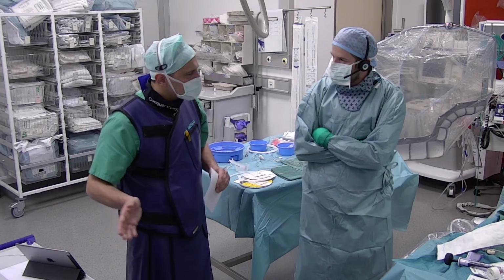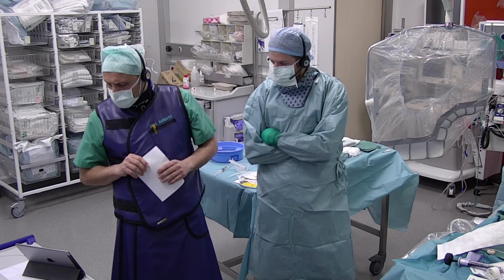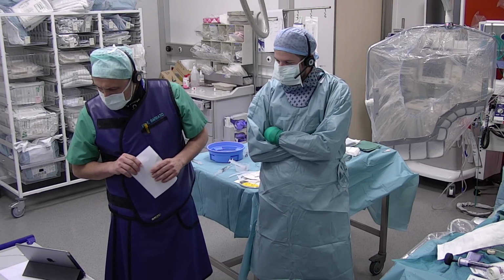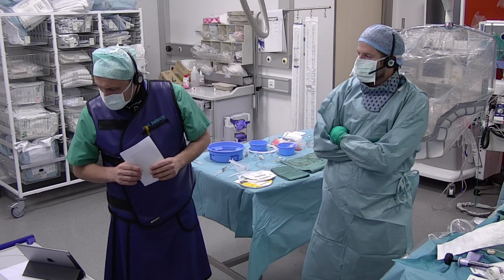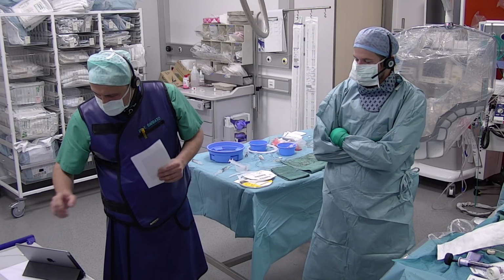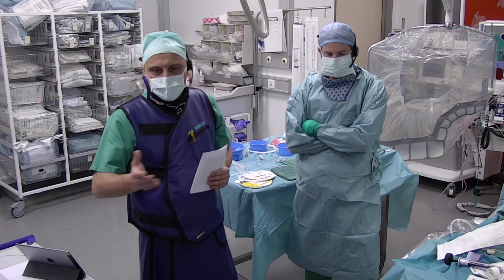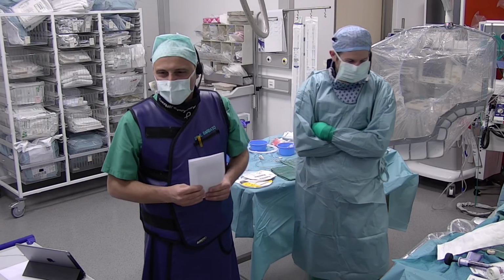Here there is a friend of Dr. Guayumi in the audience who asks, as my colleague Dr. Guayumi always teaches me, that OCT is done for measuring. So I think you can measure the left main for deciding the size of the balloon for POT. Of course, we can always measure that. We know the pros and cons, and we know that Giulio is an expert. Unfortunately, he's not with us today, and we are not as expert as he is.